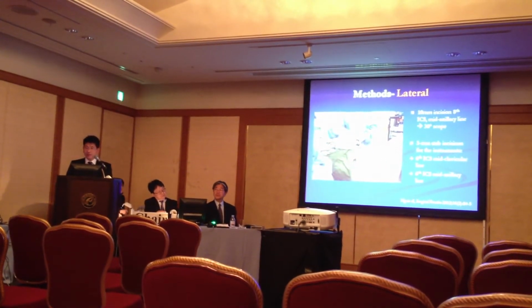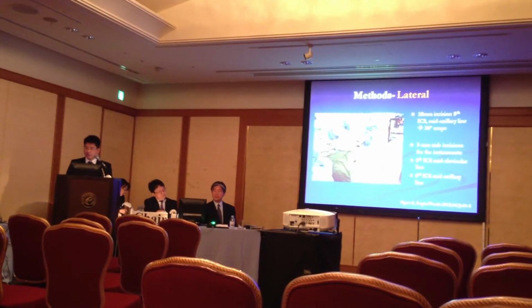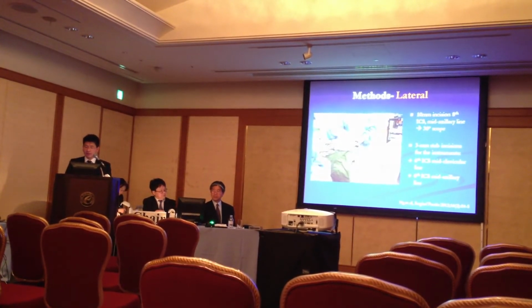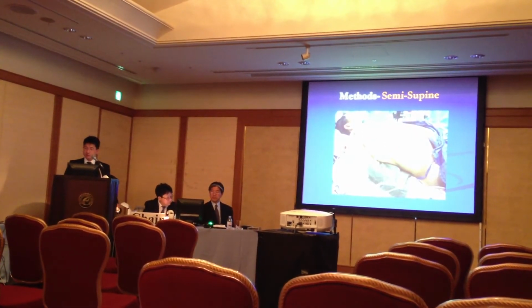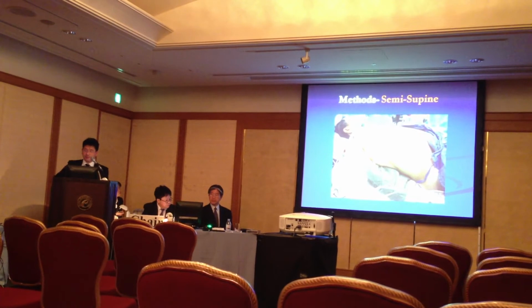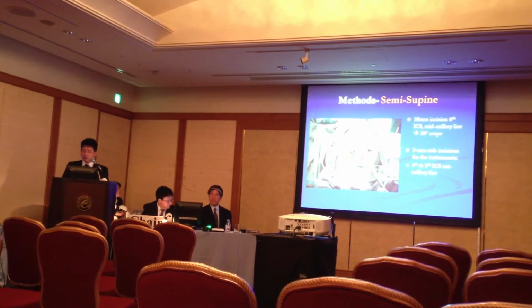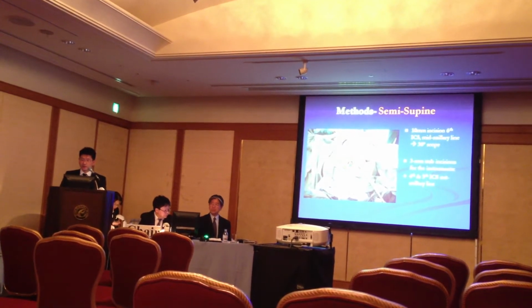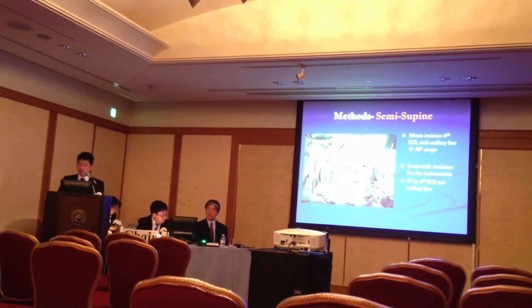So this is a full lateral position with a 10 mm incision for the scope at the mid-axillary line. We use a 30-degree scope, and then two 3 mm stab incisions for the instruments, one at the 6th intercostal space mid-clavicular line, and the other at the 6th intercostal space mid-axillary line. The alternative approach is to position the patient semi-supine with some support around the right side of the back. With that, you can place 3 ports on the lateral aspect of the chest: a 10 mm incision, again at the 6th intercostal space, with a 30-degree scope, and two 3 mm stab incisions at the 4th and 5th intercostal spaces in the axillary line, respectively.